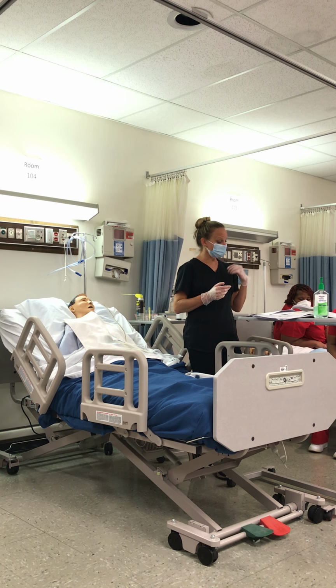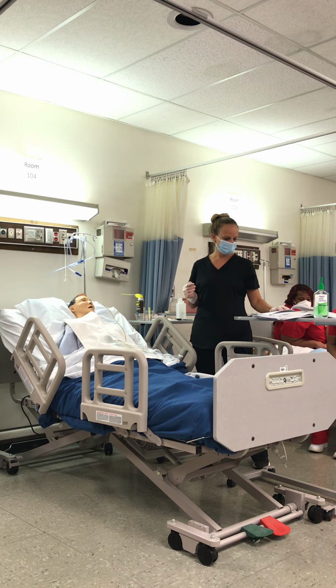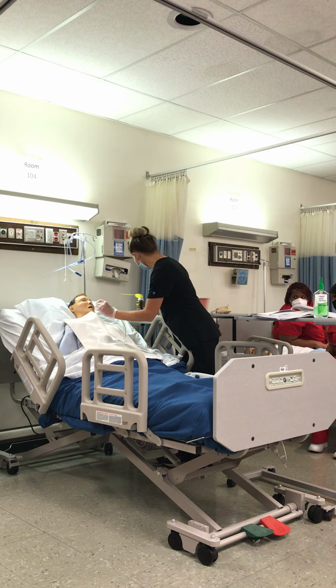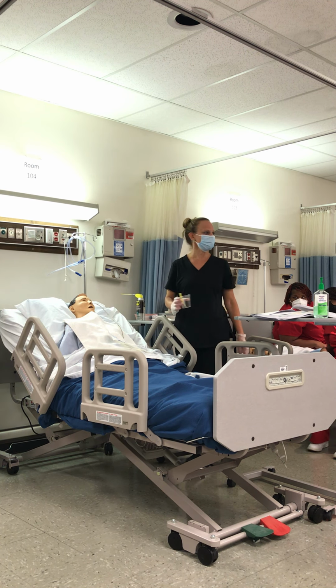So, taking a sip of that water. How far do I advance that tube as they're taking a sip? 3 to 5 inches. And then of course, what are we watching for from that patient? All right, I want you to take a swallow. Swallow. Y'all know how far 3 to 5 inches is?